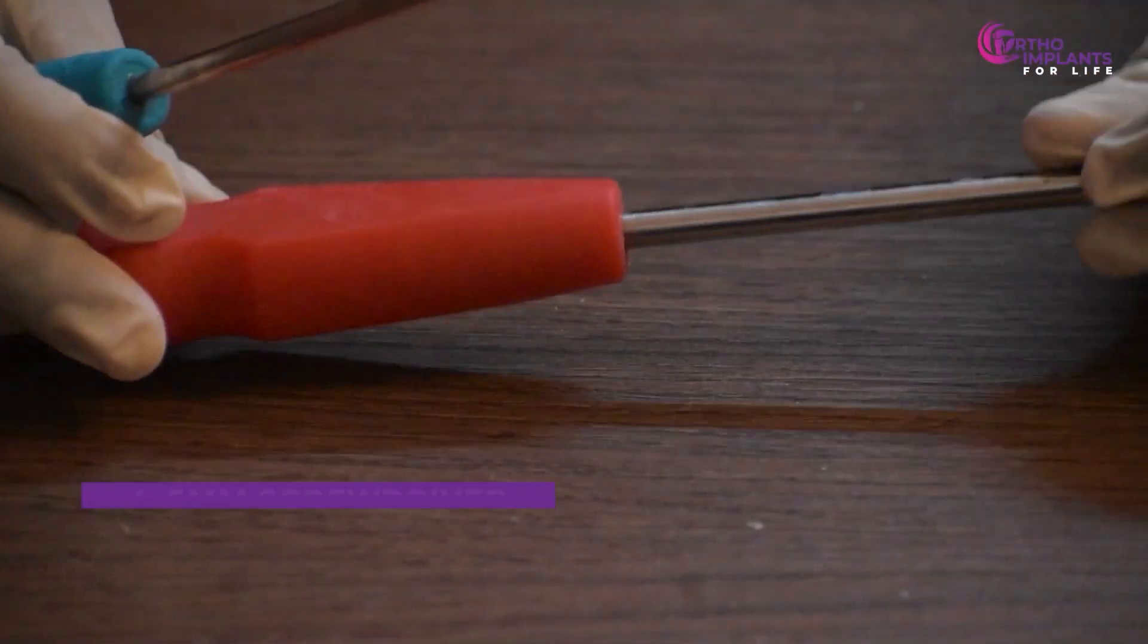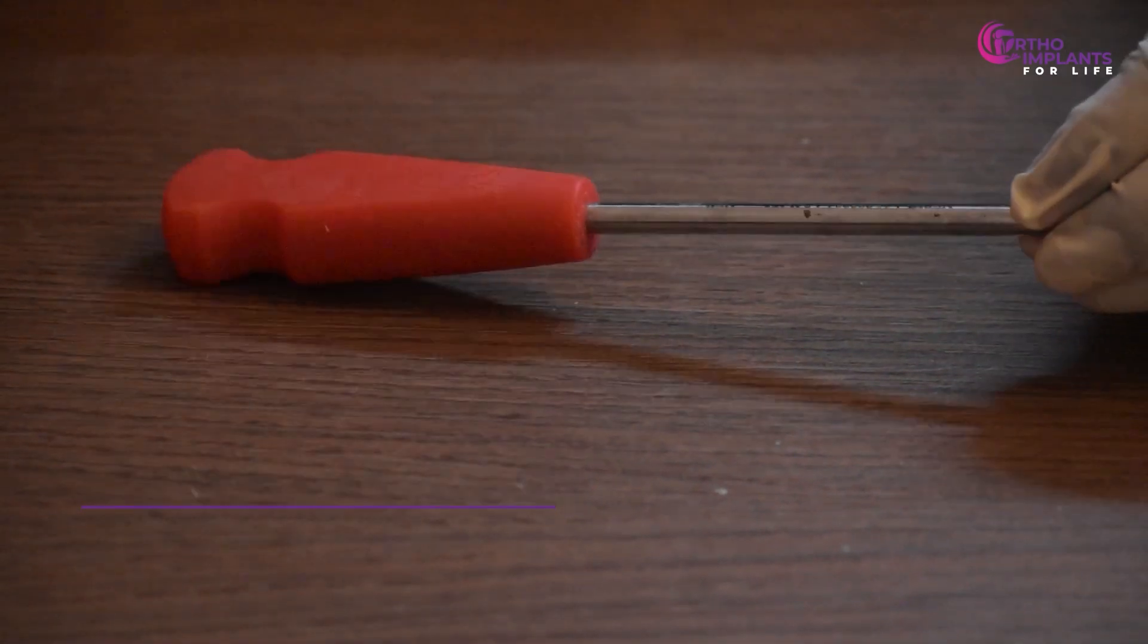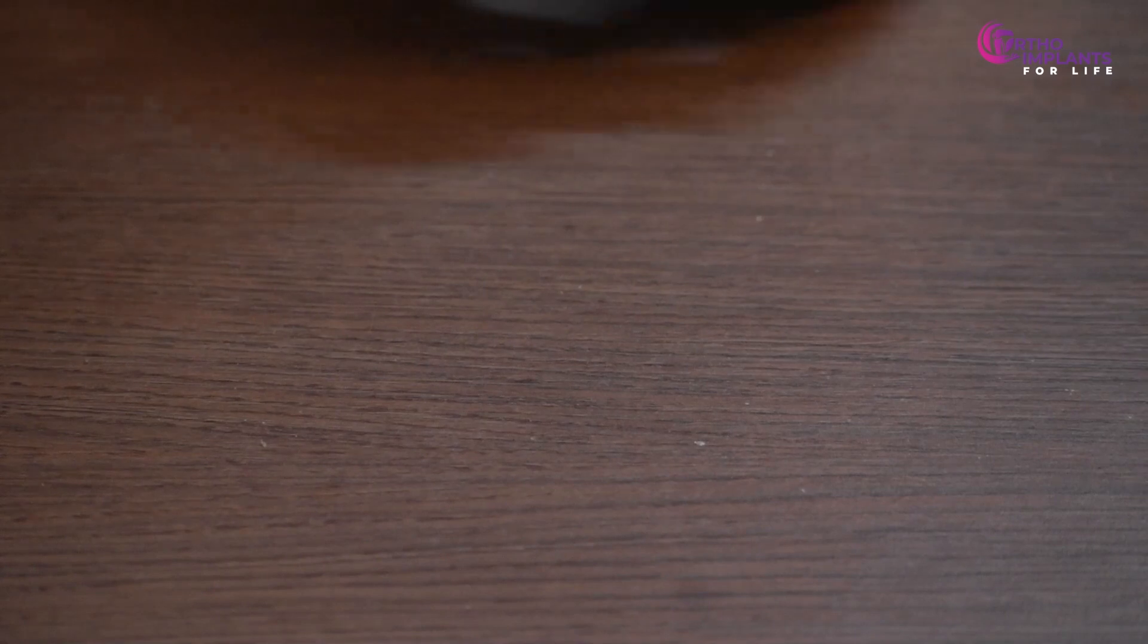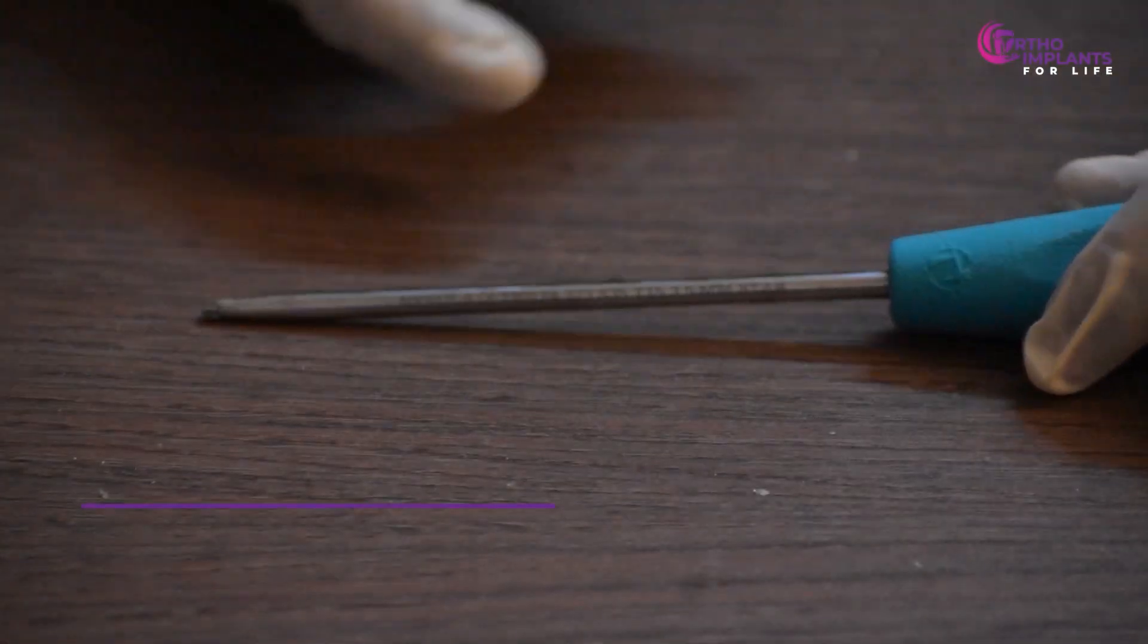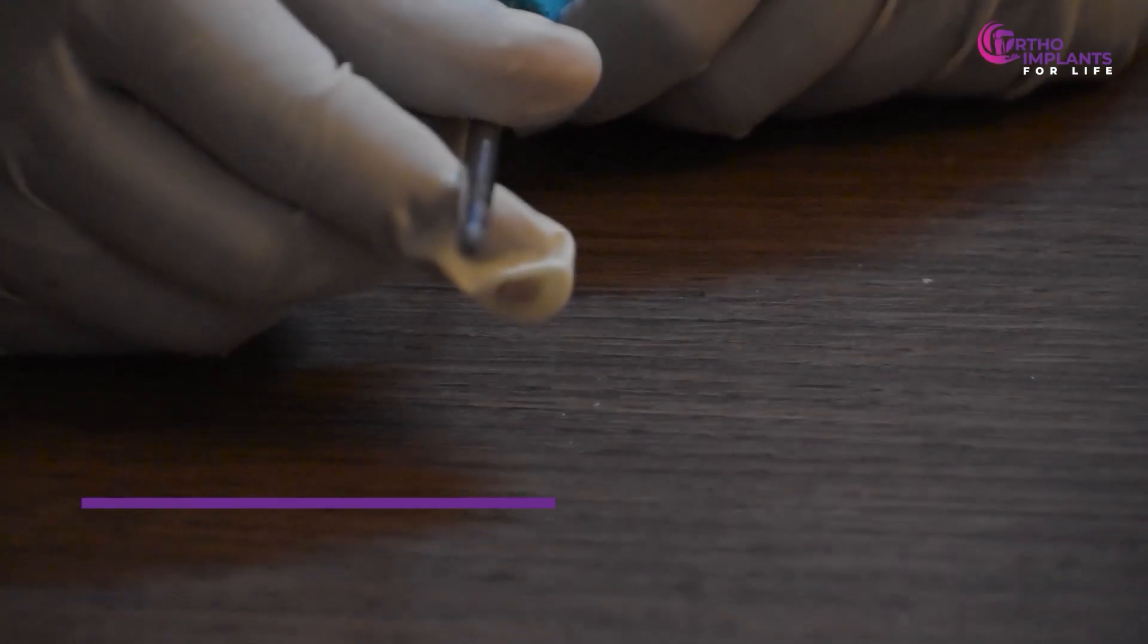And the 4.5 mm screwdriver, which is for the 4.5 mm cortical screw. This is the 3.5 mm star-headed screwdriver, which is used for the 5 mm locking screw.